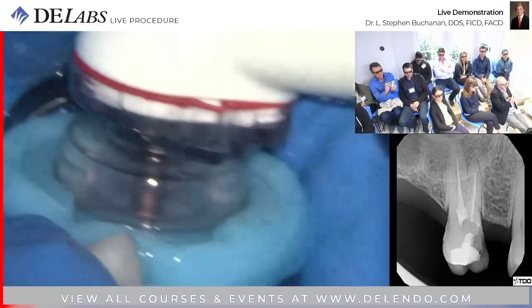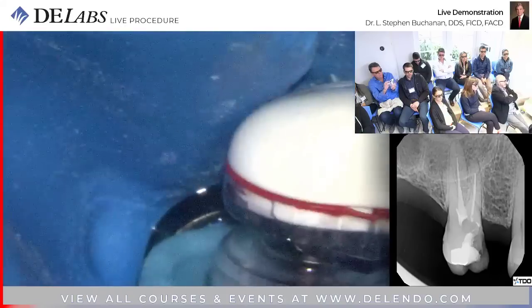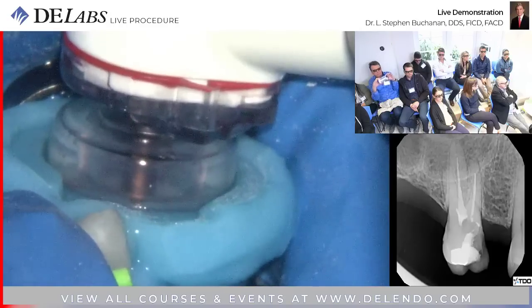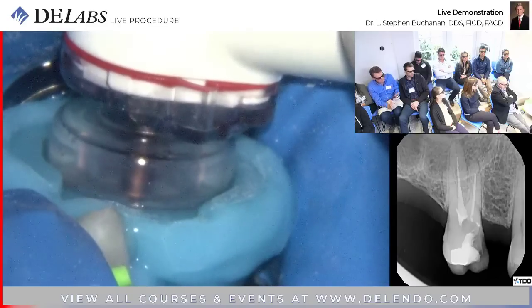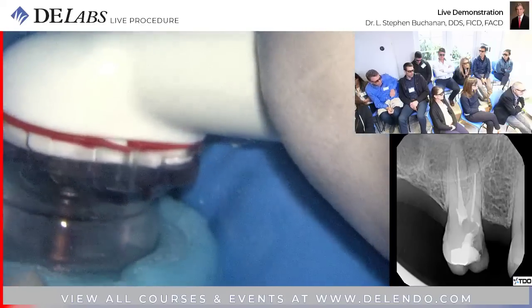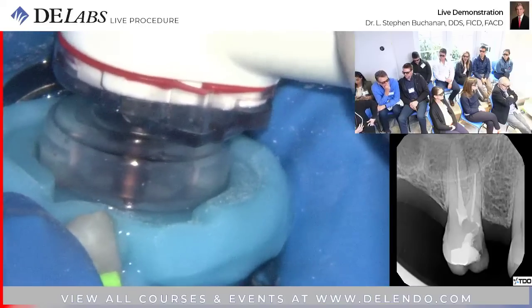What's going on with this thing? Minute and a half, 30 seconds to go.